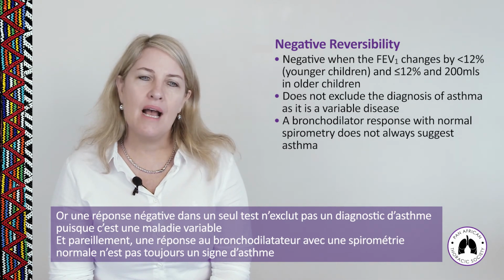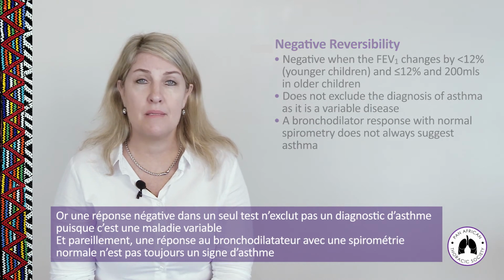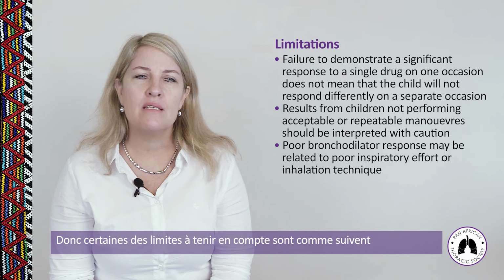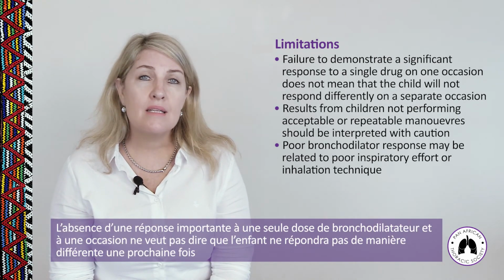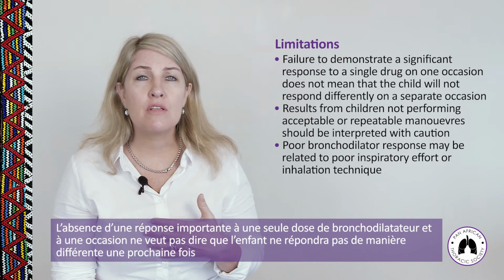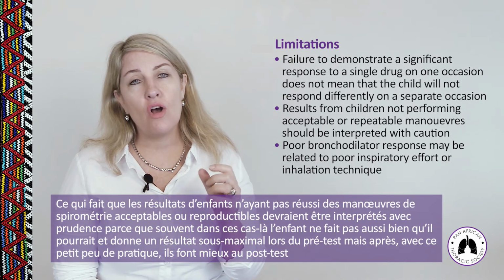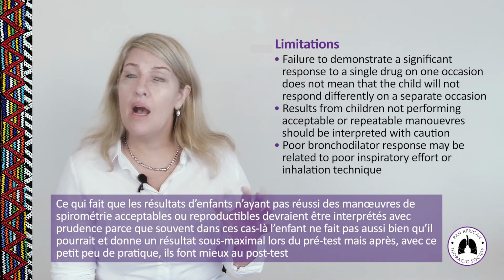And similarly, a bronchodilator response with a normal spirometry does not always suggest asthma. So some of the limitations that you need to take into account is that failure to demonstrate a significant response to one single dose of a bronchodilator on one occasion does not mean that the child will not respond differently on a different occasion.